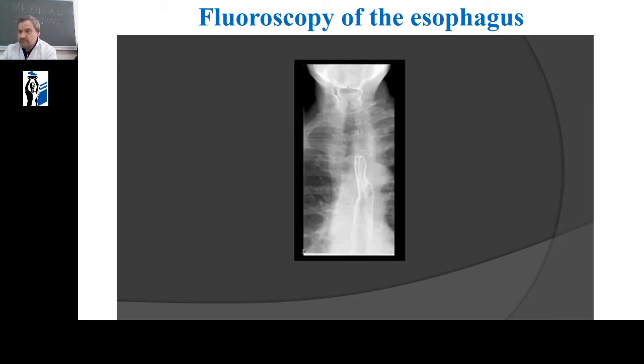However, fluoroscopy in modern conditions has another very important application in interventional radiology. The X-ray surgeon saw the problem, performed minimally invasive manipulation through the vessels under the control of X-ray examination, and then looked at the result of his intervention again.